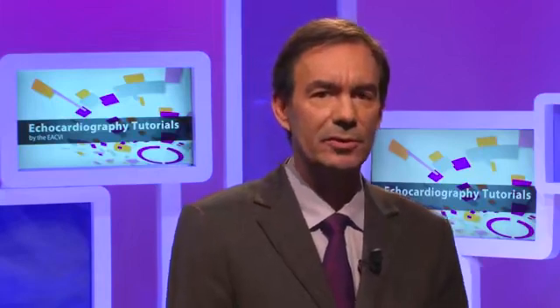Raluca Dulgeru will show us how to assess patients with mitral stenosis. She will go through the specific findings that we have to look for at the level of the mitral valve. Then she will move to how to assess the severity using the various methods available. She will also address the limitations of this method.